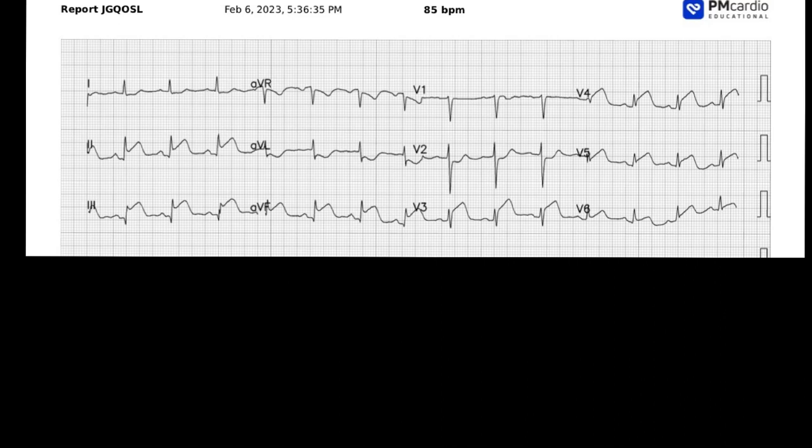Good day, everybody. This is Chris at the Ancient Scholar. I hope this video finds you all doing well. Today, I'm going to review a case study that is associated with a rather unique ECG. So let's go ahead and get started.